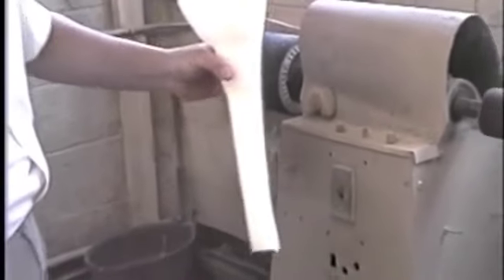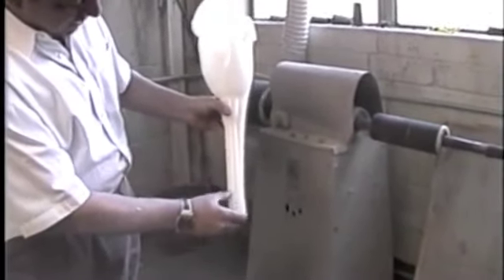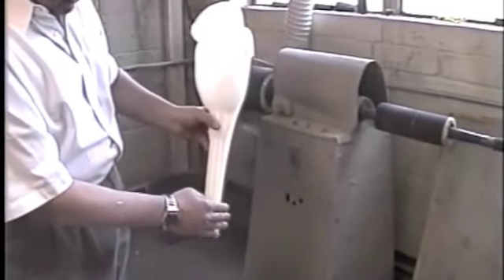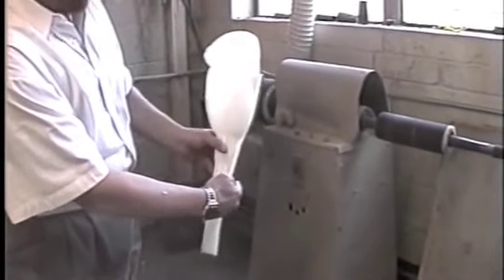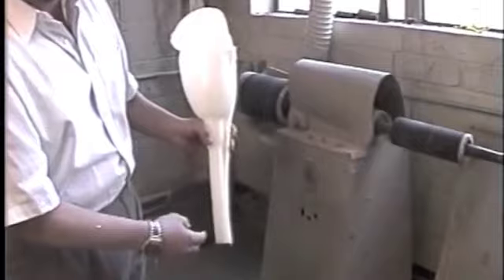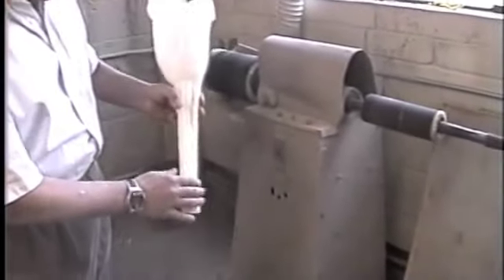Okay, notice here, the way we trim the seam down, that's the way you want to trim it. Always a gradual transition into the pylon. For example, in this case, if the proximal surface of the pylon is going to end up here, that's a pretty good place to start. If you want to leave it more rigid, you can gradually taper the socket further out so that you can leave it a little bit higher, and that'll make the prosthesis more rigid so that when you dynamically align it or go through the fitting stage, you can little by little trim off the posterior seam, which will in turn make the pylon more flexible. This is good for a start for this particular patient.